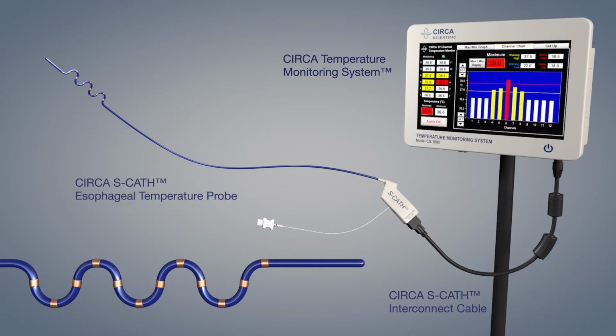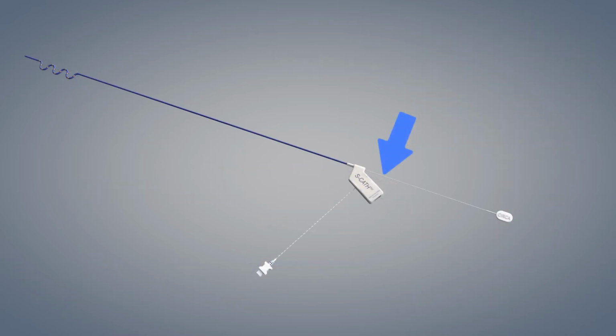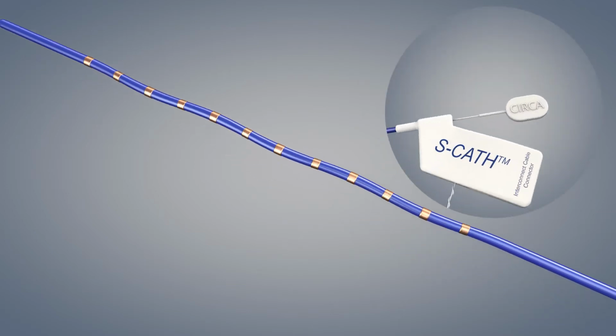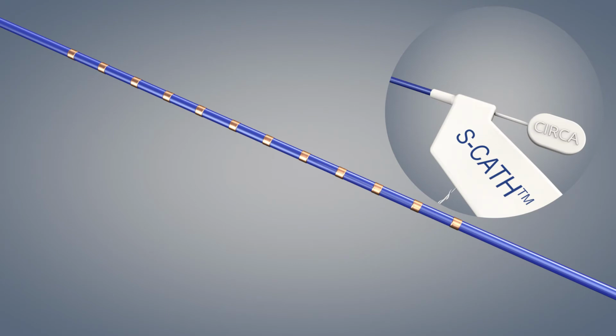Carefully remove the probe from the packaging. Hold the stylet close to the connector housing and allow the probe to hang vertically. Advance the stylet completely until the white end of the stylet reaches the connector housing. Apply a water-soluble lubricant to the outside of the probe and insert the S-CATH immediately into the esophagus.